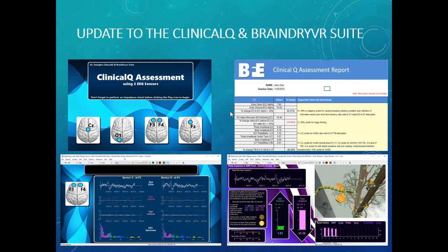I see David has a question. I thought I saw something about heart rate variability biofeedback in the 7-year-old report. Does the new suite feature heart rate variability or heart rate measurements and integrate the results? David, the new suite does not feature the inclusion of heart rate variability.